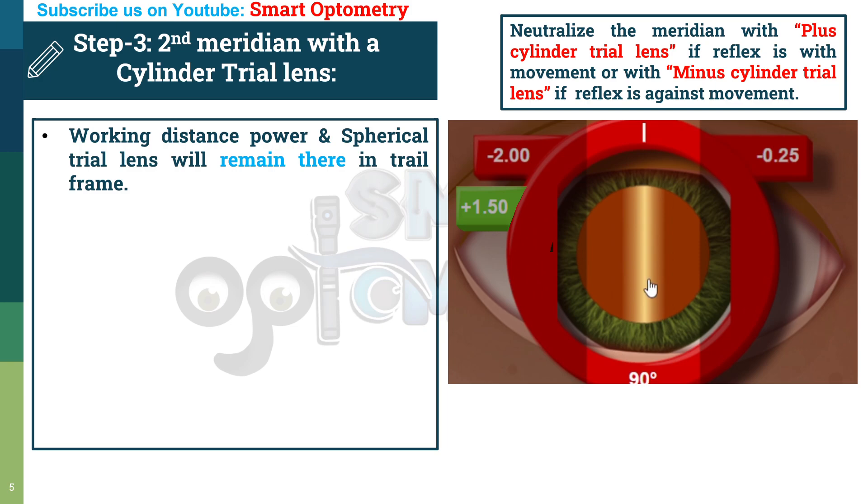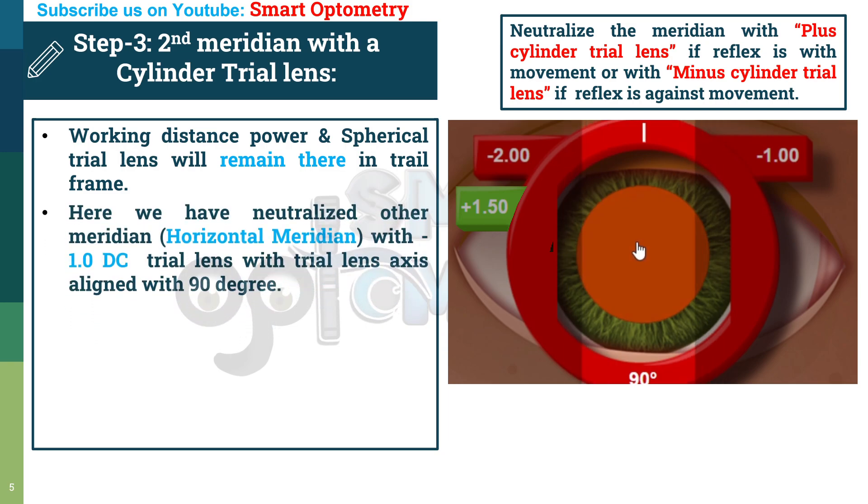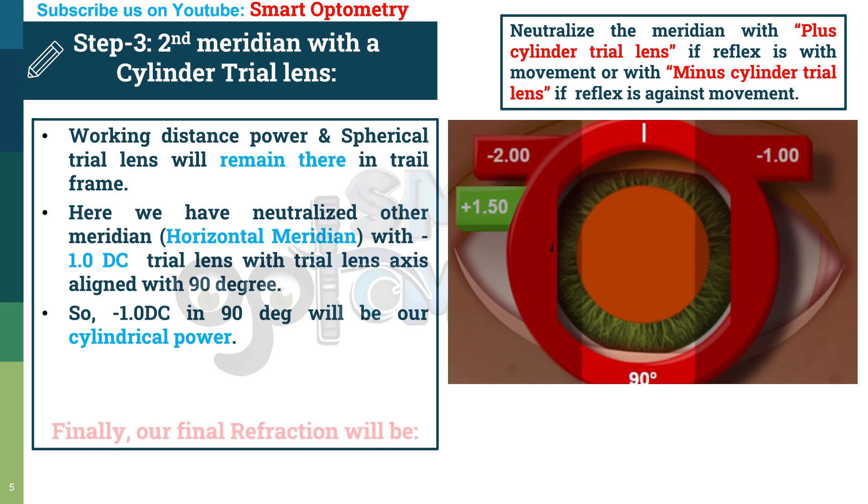Adding cylinder lenses: with minus 0.25, the movement is still against. With minus 0.75, still against. Finally, with minus 1 cylinder trial lens, this meridian is neutralized. We have neutralized the horizontal meridian with a minus 1 diopter cylinder trial lens, with the trial lens axis aligned at 90 degrees. So minus 1 diopter cylinder at 90-degree axis will be our cylindrical power.